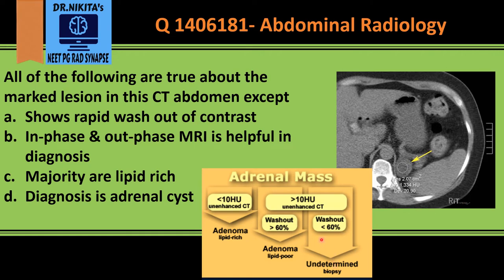To revise: on a non-contrast CT, less than 10 HU is a lipid-rich adenoma. If more than 10 HU, we proceed with contrast scan and a 15-minute delayed scan to check washout. More than 60% washout is a lipid-poor adenoma; less than 60% is indeterminate and needs biopsy. In this image, the HU value shown is 1.3, which is less than 10 on a non-contrast scan — so the diagnosis is lipid-rich adenoma.